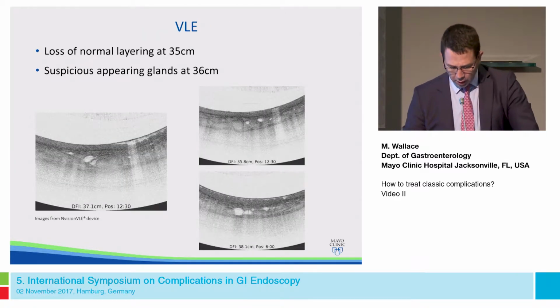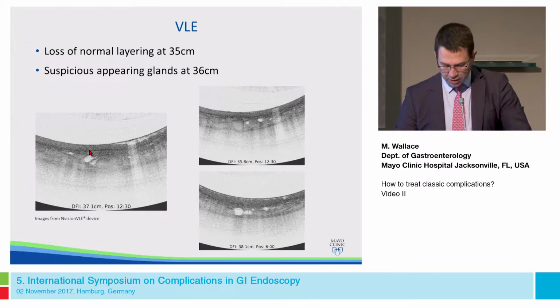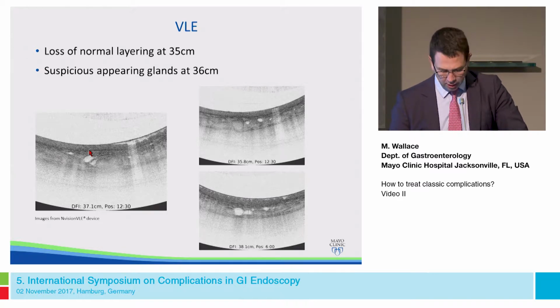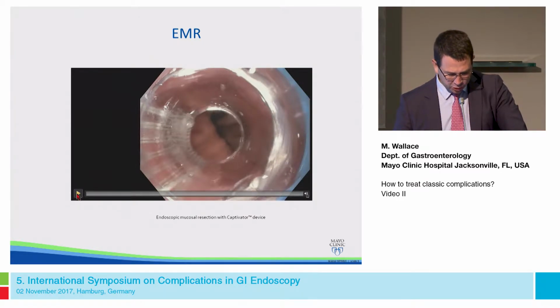So we mark this. We use a technology called volumetric laser endomicroscopy as a supplement to our endoscopic imaging. And we, in fact, observed what we thought was some subsquamous Barrett's. The squamous epithelium is denoted by this layered epithelium here, whereas the Barrett's esophagus here loses its epithelium layer. And we saw these abnormal glands underneath squamous epithelium. So this further suggested that the patient had some slight 1 to 2 millimeters of Barrett's dysplasia underneath the squamous epithelium. This will become important as you see here.